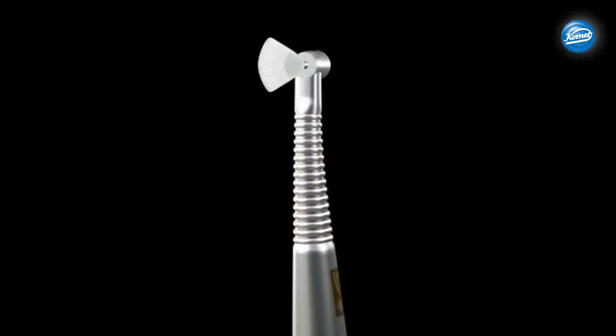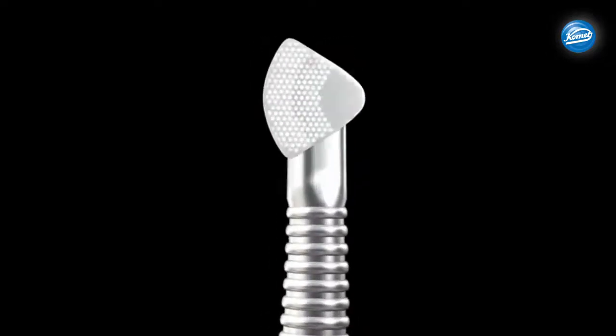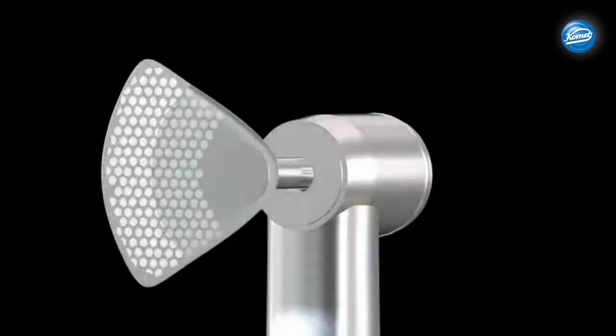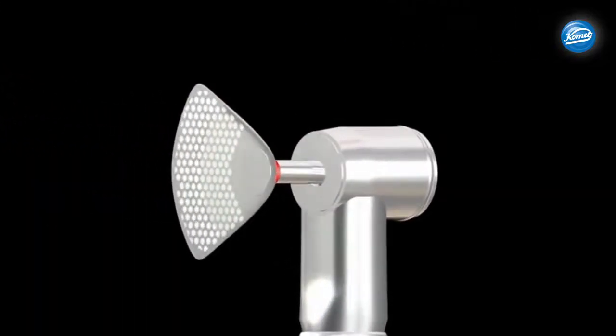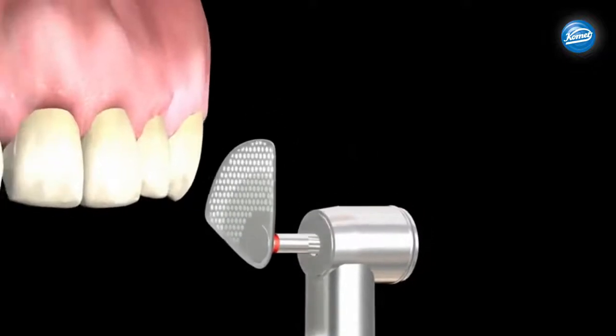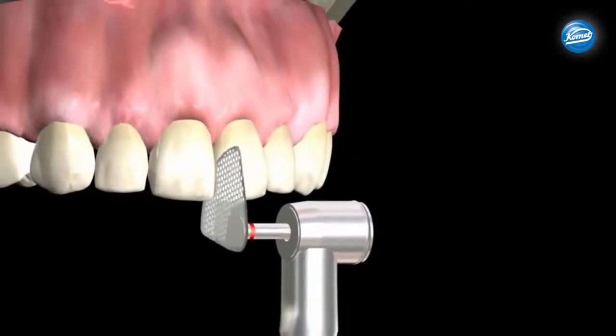The segmented discs are exclusively designed for use in the oscillating Komet Contra-Angle OS30 handpiece. There is a 6mm diamond coating on each disc, which produces excellent grinding efficiency. Engage the handpiece before doing interproximal reduction. The oscillating angle of the discs is 30 degrees — 15 degrees in each direction.